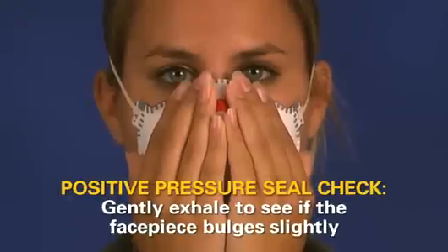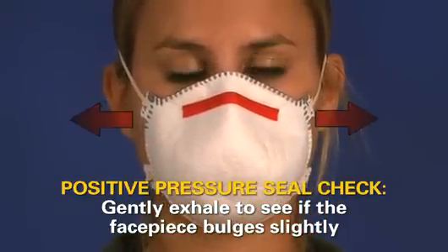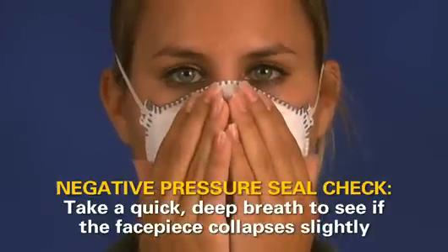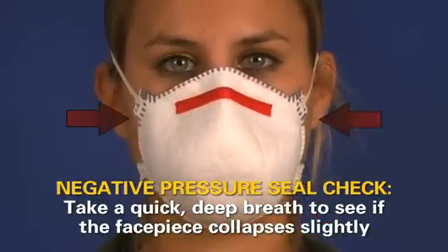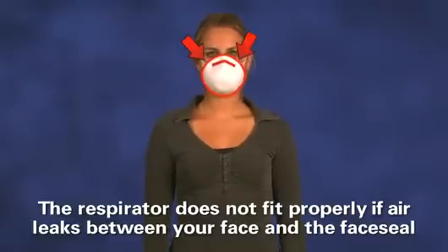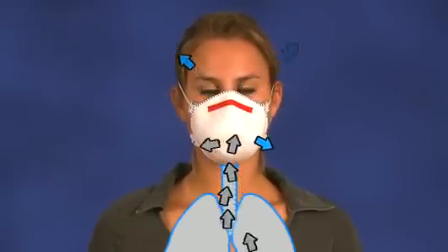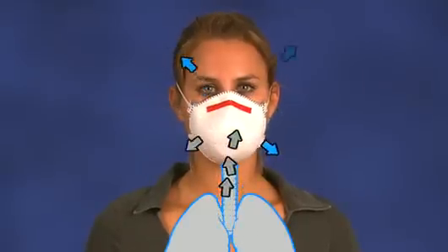Generally speaking, the manufacturer's instructions are based on covering the surface of the respirator, usually with your hands, so that air is prevented from passing through the filtering face piece. A positive pressure seal check is performed by gently exhaling to see if the face piece bulges slightly. For a negative pressure seal check, take a quick deep breath to see if the face piece collapses slightly. During either test, if air leaks out between your face and the respirator's face seal, the respirator may not fit your face properly. One way that you can identify leakage is if you feel air blowing through the seal onto your face or eyes.